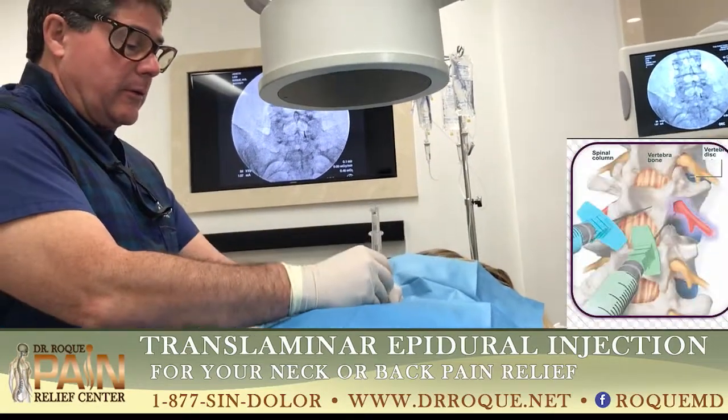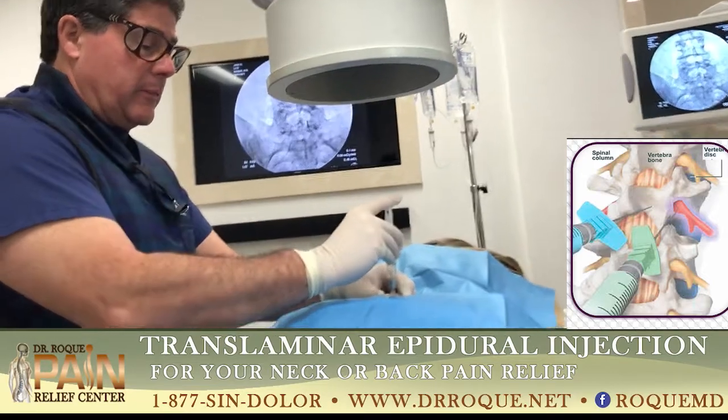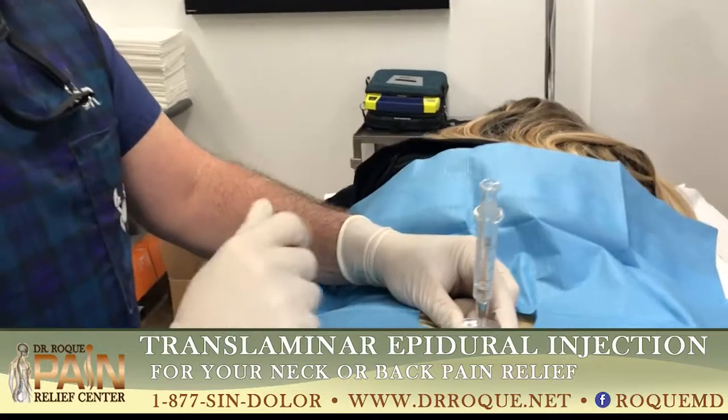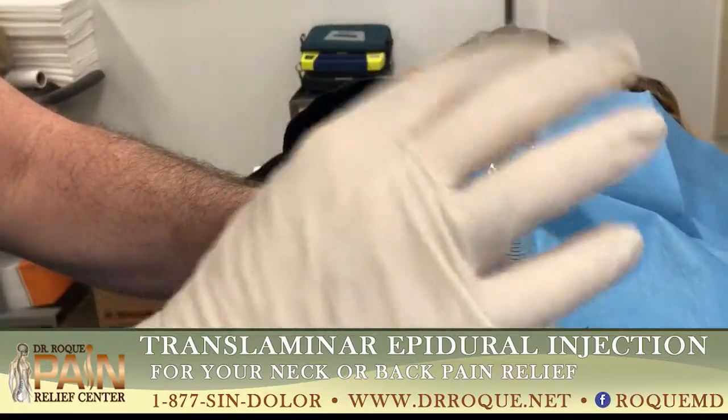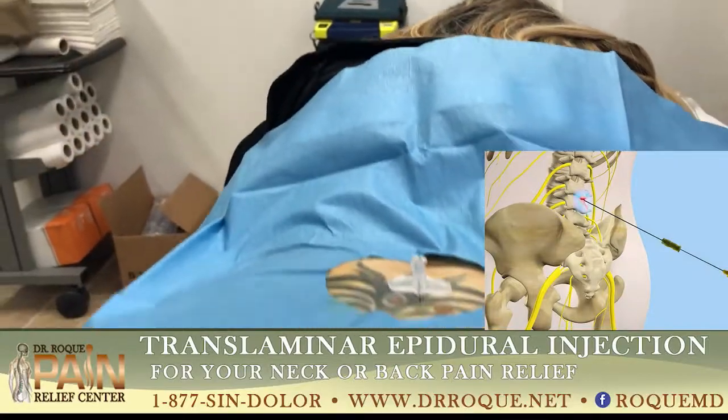In a second, I'm just going to go a little deeper — no te mueva — and it's going to go like this, a little deeper, a little deeper, and all of a sudden you're going to see the loss of resistance. So it's loss of resistance right now, no resistance. I'm in there.